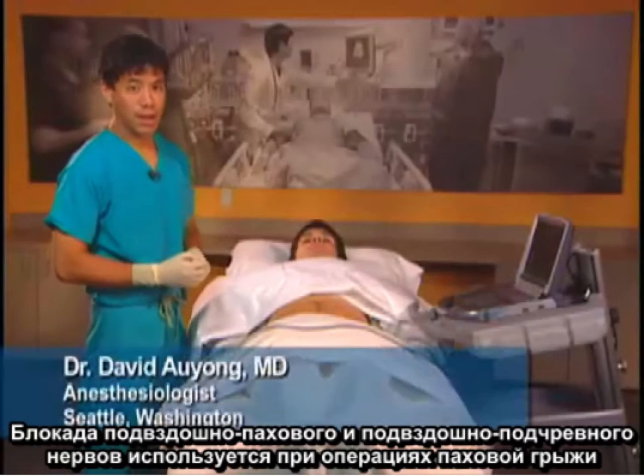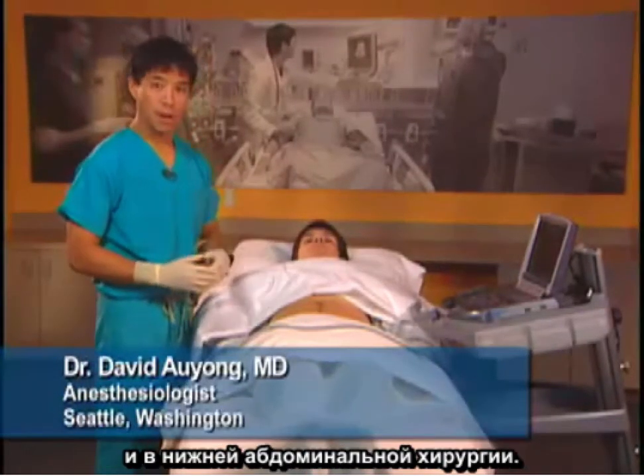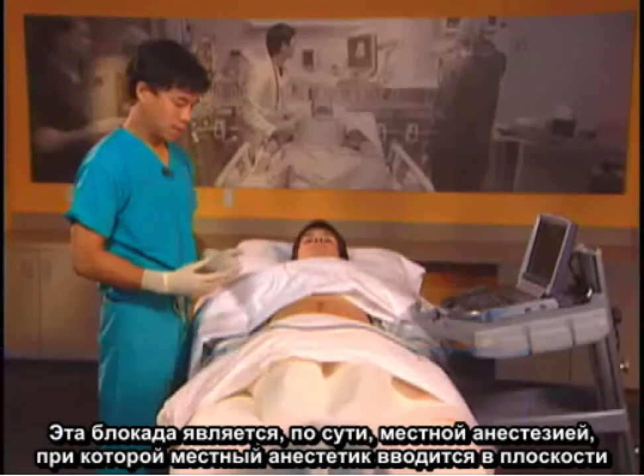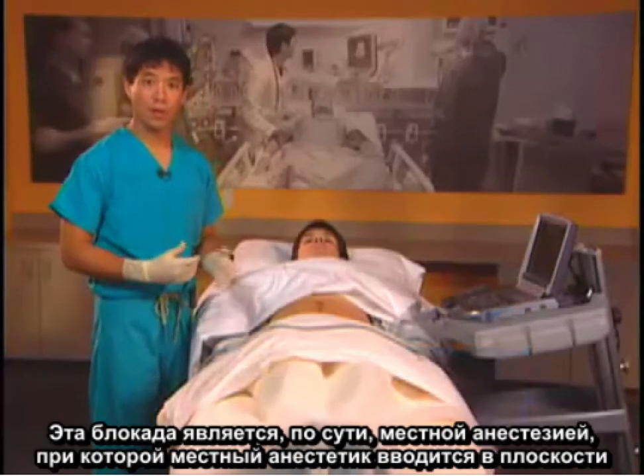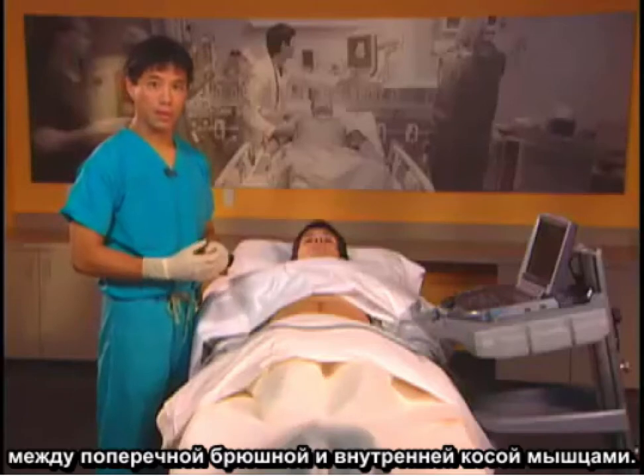The ilioinguinal iliohypogastric nerve block is used for inguinal hernia repair and lower abdominal surgery. This block is a field block where we put the local anesthetic within the plane between the transversus abdominis and the internal oblique muscle.